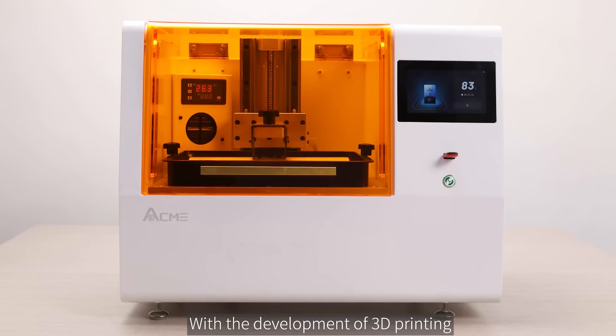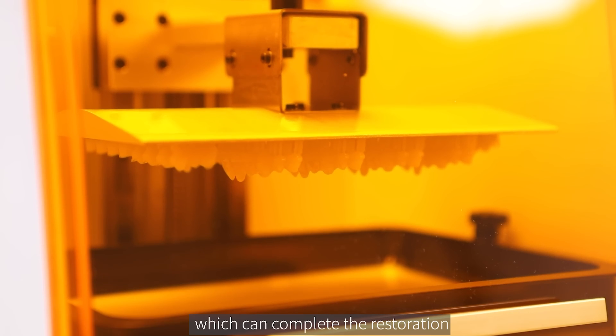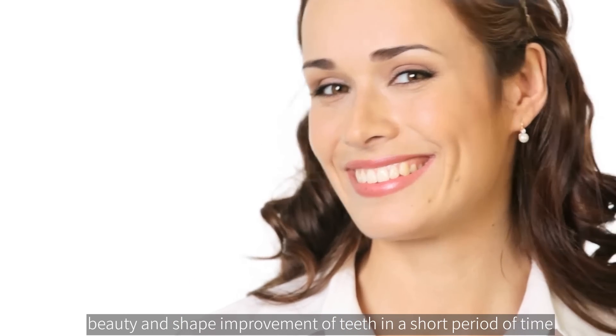With the development of 3D printing, 3D printing temporary crowns have become a common technique for dentists, which can complete the restoration, beauty, and shape improvement of teeth in a short period of time.